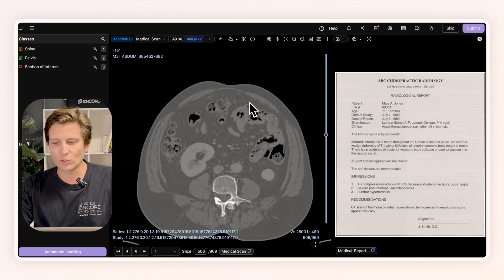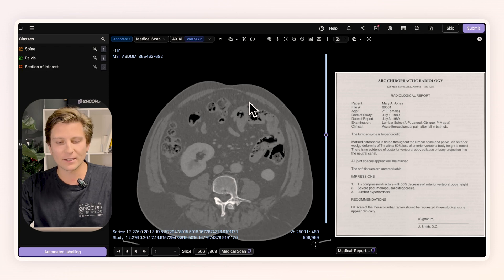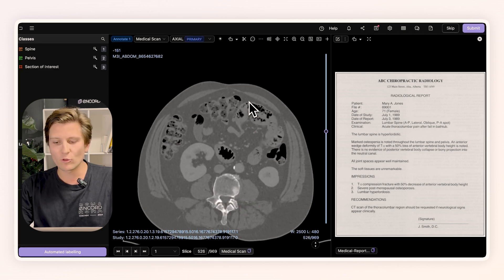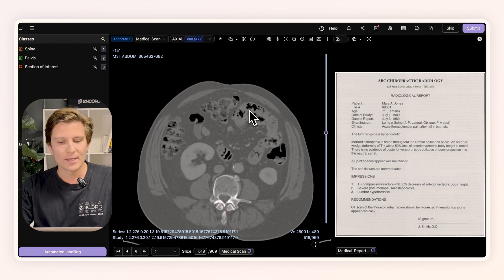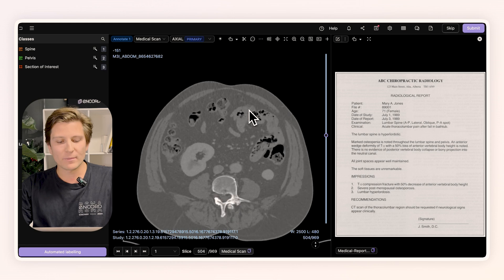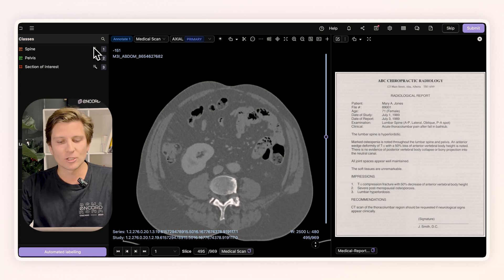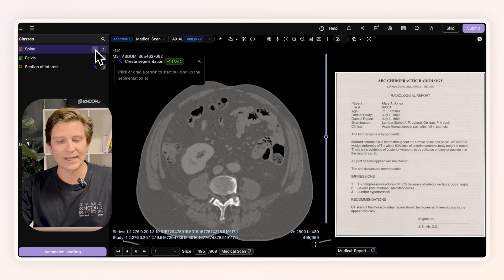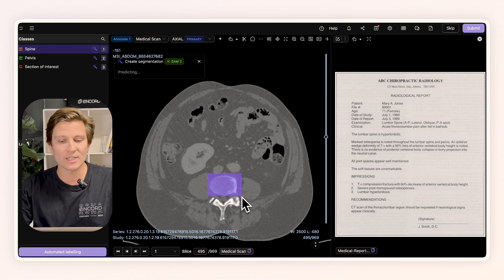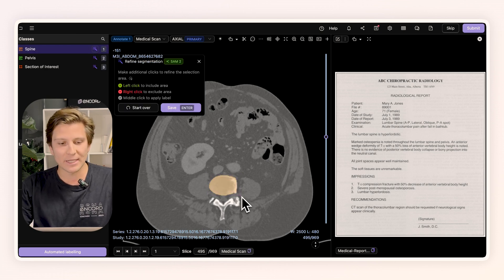Looking at these two items, you can see on the left we have this medical scan that we can scroll through, and on the right we have the patient notes. If you want to make geometric annotations on the medical scan, we can use functionality like Segment Anything to go ahead and label these structures with high precision, accuracy and speed.